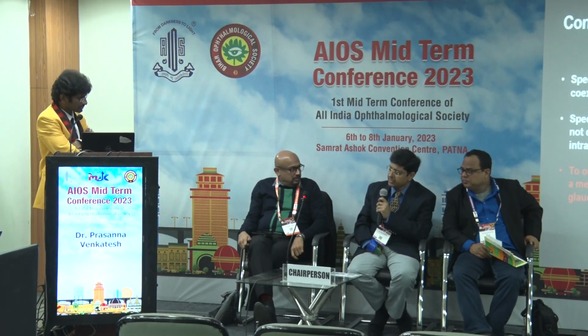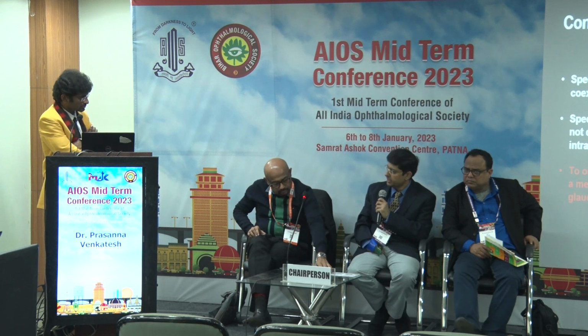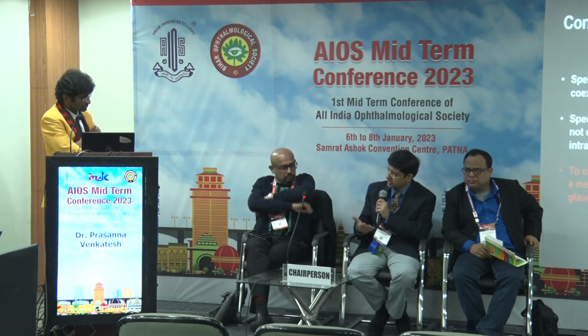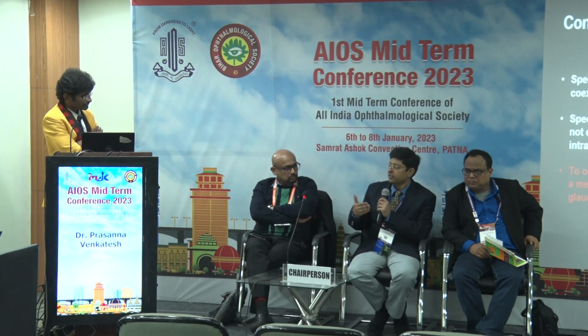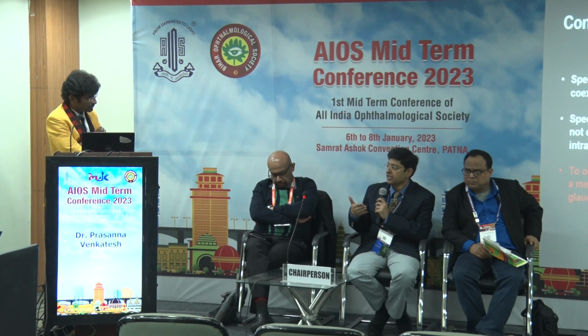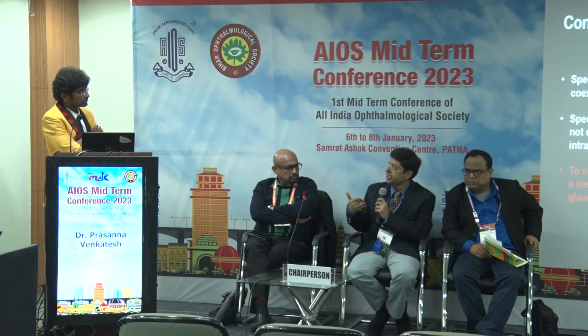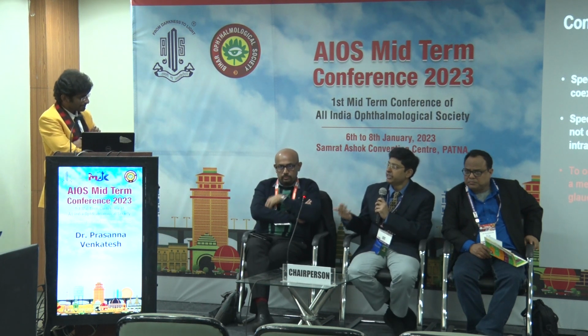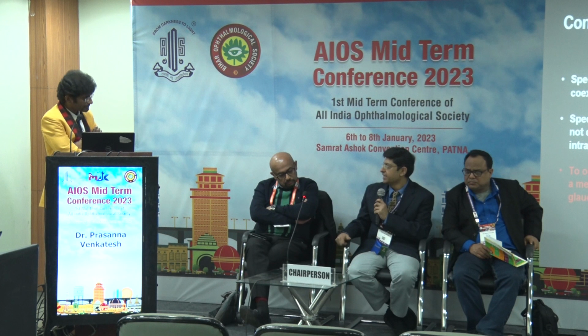Yes, sir. I guess, as we are seeing with time, technology is evolving in our understanding of information from there. The only, of course, important thing to remember whenever we're dealing with technology is the minimum change before which you consider it significant. So, consistency of the change and the minimum variation before which we can take it.